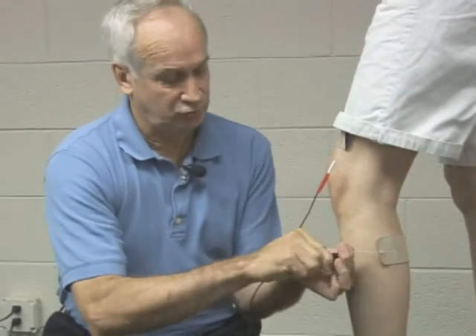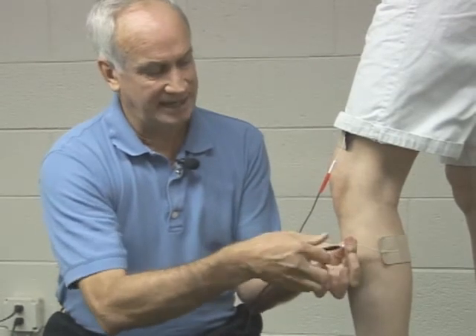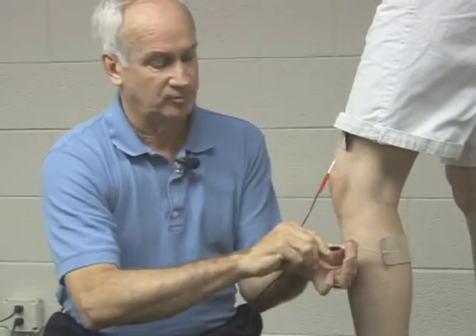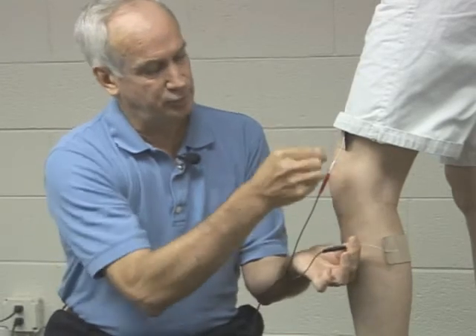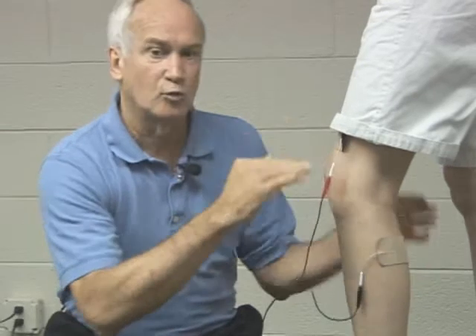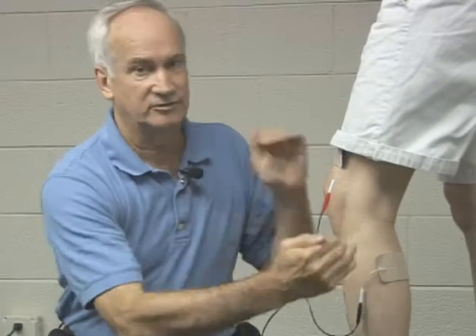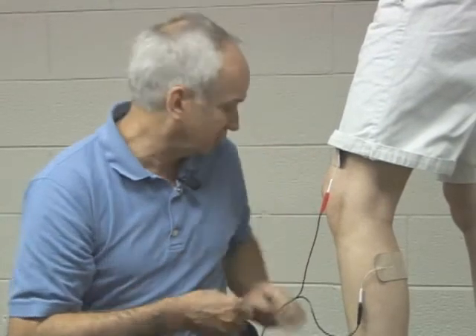Turn the unit off — anytime you're changing electrodes, turn the unit off. You can actually take the red or the black and intercross them: pull this one out, put it in here; pull this cable out, put it in here. There is a slight difference because on one setup you have electrons going in a direction, and if you switch the direction they're going, it will change the sensation some.